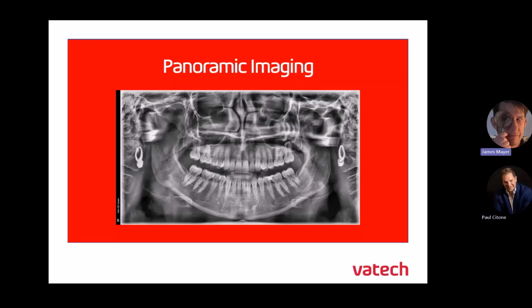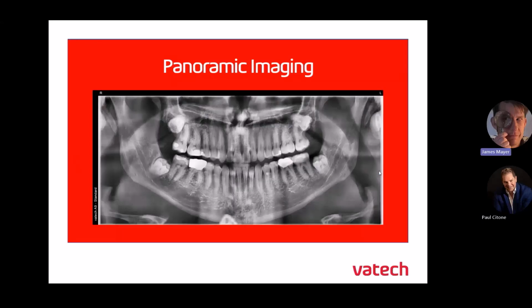Yeah, so I think that's the thing: we get our earrings in here and the sinuses, we get that streaking effect and the distortion above those earrings. Otherwise, beautiful pan. Let's look at one more before we conclude. What are you seeing here on this image? See that little white area on the bottom portion of the image, which is going to be the vest essentially creeping up on the back of the neck, causing that little white spot there.